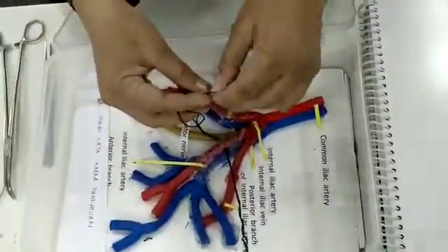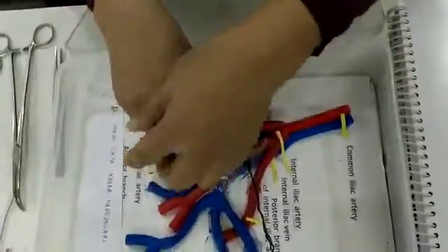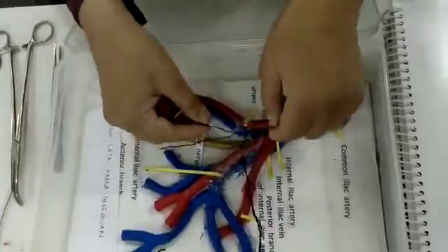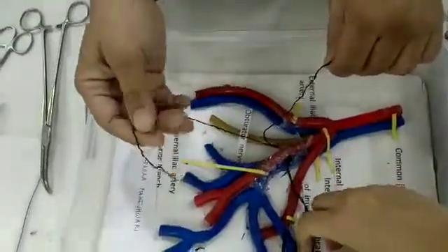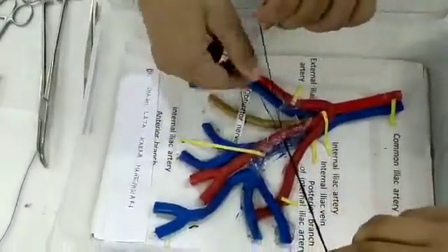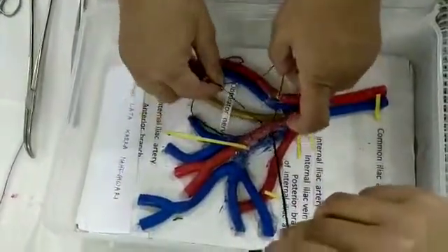Assistant, please help me. Don't pull it, don't pull it.